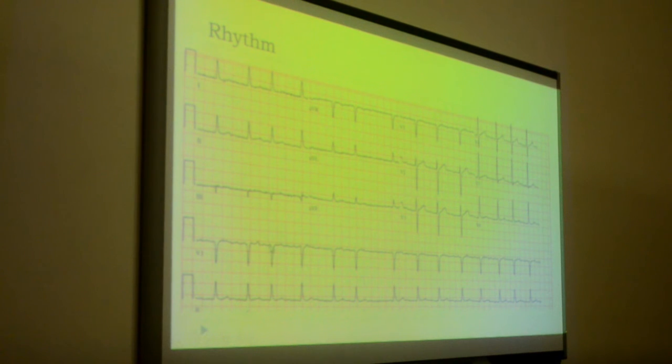V1? Okay, yeah. Can I measure the rhythm from here? Okay, sure. I will try from this one here, exactly. Okay. So 1, 2, 3, 4. This is 4. And then the fourth, 1, 2, 3.5.